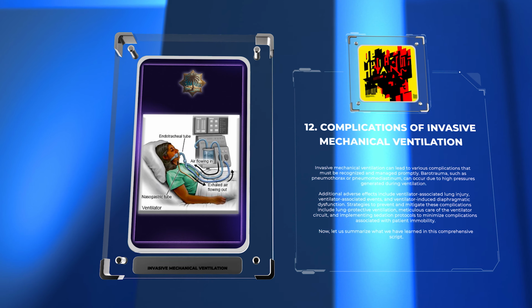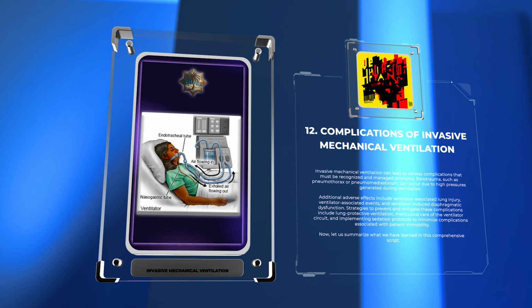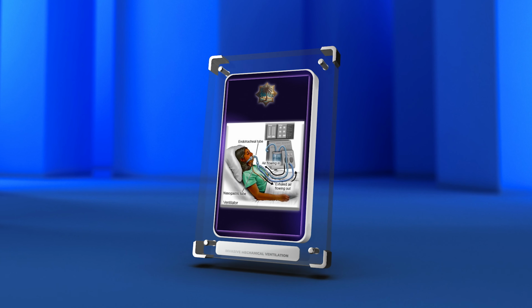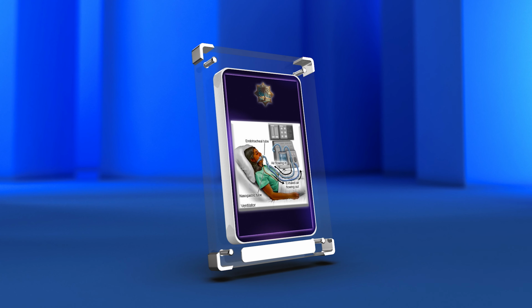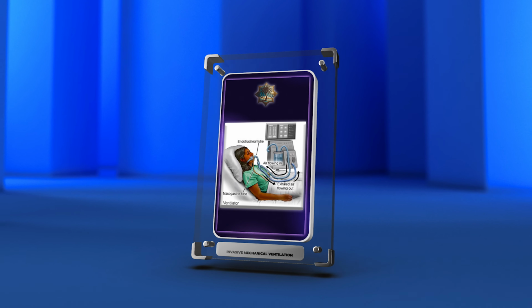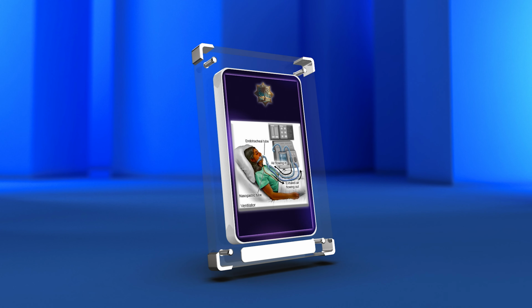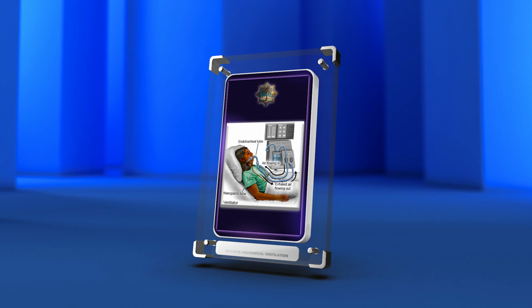Now, let us summarize what we have learned in this comprehensive script. Invasive mechanical ventilation is crucial for severe respiratory failure. Understand indications and contraindications for proper utilization. Learn about ventilator modes, lung protective strategies, and complications. Your knowledge will improve patient outcomes.